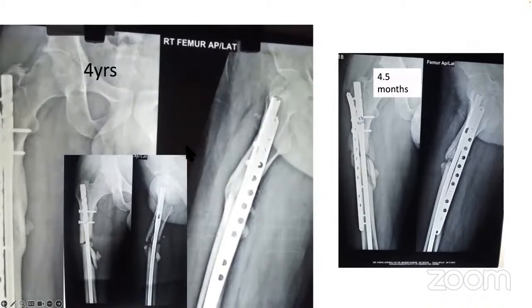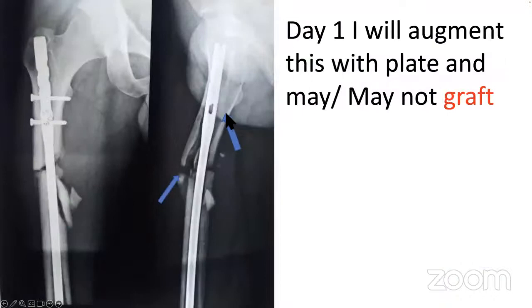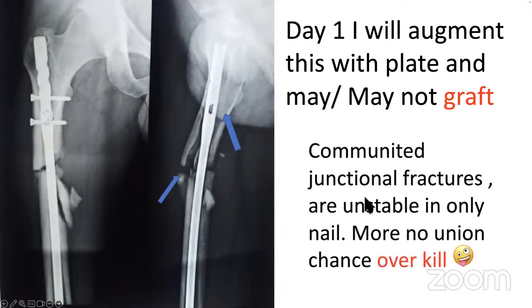But see, on day one, with this sort of fixation, when this is almost floating into the proximal fragment because of the comminution, the distal fragment has a decent hold. So with this type of fracture, if you see it on day one, probably I'll augment this with the plate, the thing which was done for a non-union. I will not hesitate to augment this with the plate. So this overkill is probably the treatment of choice for this sort of fracture.